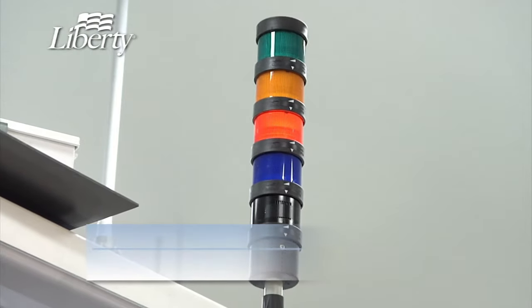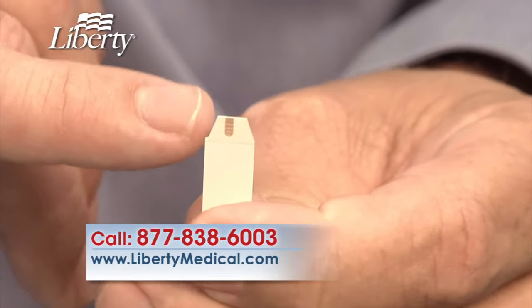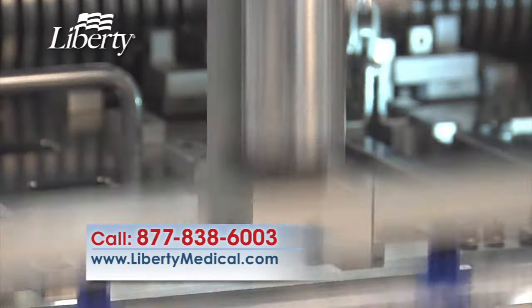At the end of the process, we punch a beveled tip that helps you test successfully the first time with just a half microliter of blood. It's one of the features that helps to ensure a less painful test.